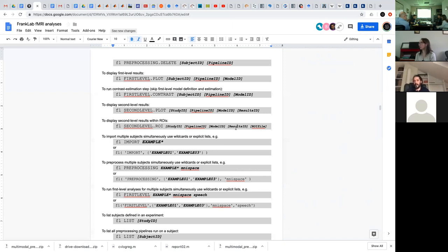So there's sparse acquisition anyway, right? Yes. Well, many of our studies are. Although I've been running my first level with the AR1. Is that the same thing, or is it different? AR1 is the typical model that you use when you have continuous data, basically. And if you have sparse data, you should use none for the temporal correlation.